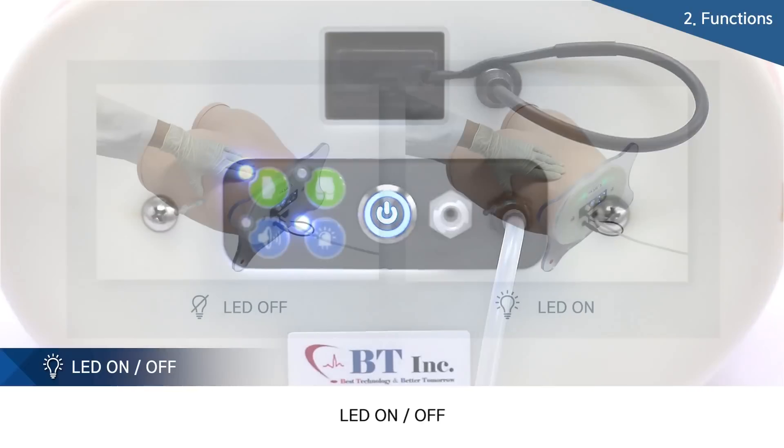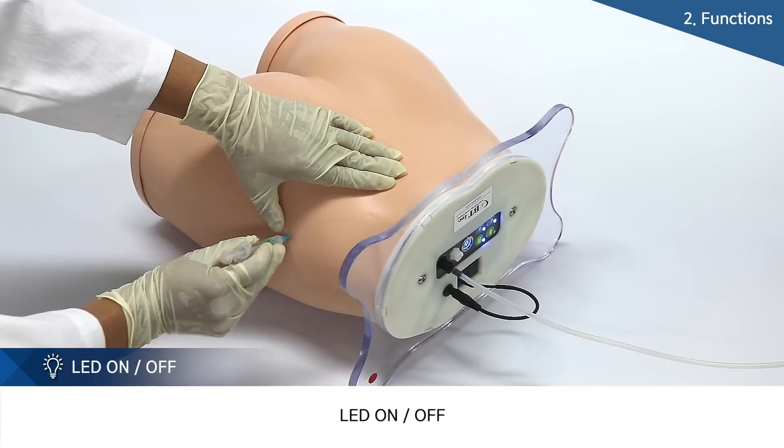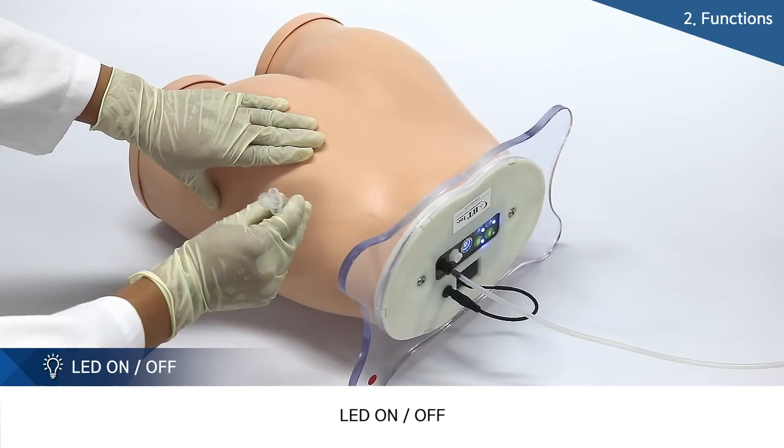When injection is done at a correct site, users can confirm it through a green lamp on the upper part. When injection is made at a wrong site, a red lamp will be lighted.